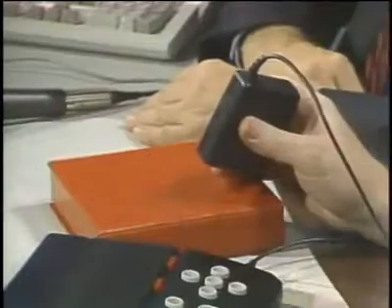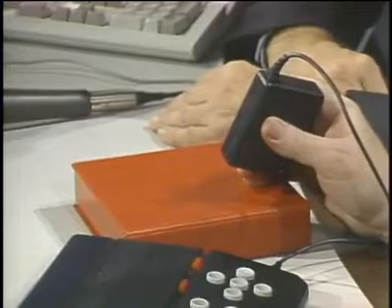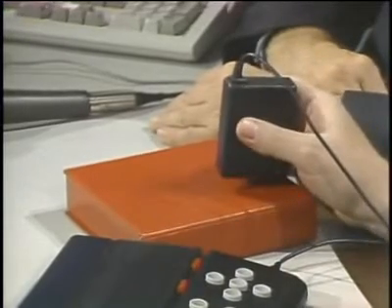Lastly, just a little bit of time left. How about the color sensor part of this? Could you show us that, BT? We're going to bring up a program that actually enables us from a disk to put the sensor on various materials. So you've got a box in front of you, and it can tell what color the box is? It's going to tell me what color the box is, as soon as it tells me that it's up and ready to go. All right, it says it's ready.